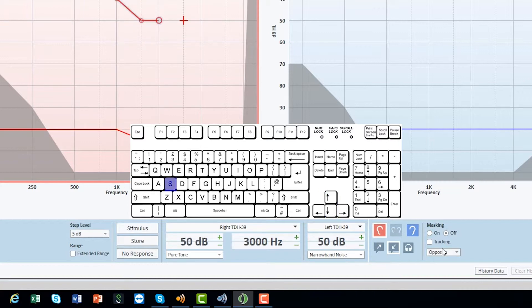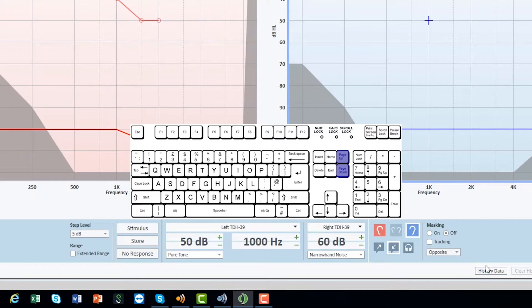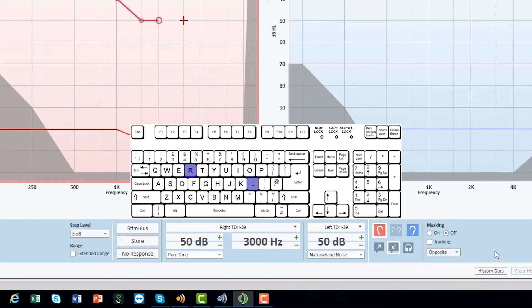To activate or deactivate masking, use M. To operate the masking level, use page up and page down. To switch between left and right, use R for right and L for left.